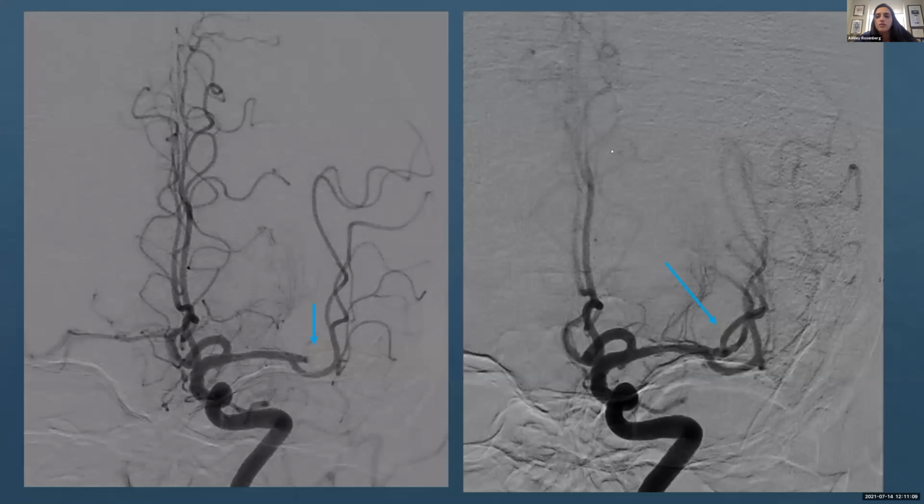Oh, this is something. So in terms of the contrast dye, someone asked how it can stay just restricted to the arterial compartment. So it doesn't. That's actually true. We don't get it. So it's a timing thing. So we know within a certain time period and we can track it. And actually, usually by the time, practically speaking, we get it both in the arteries and the veins. But we want to make sure we actually time it. We do like a little test bolus, like a little test run to see, oh, at 10 seconds, at 15 seconds, it's going to be there.